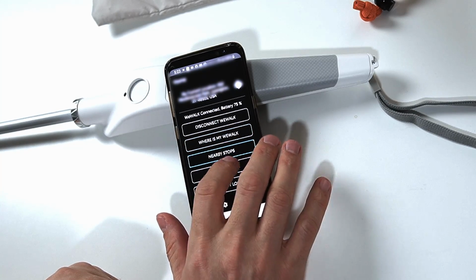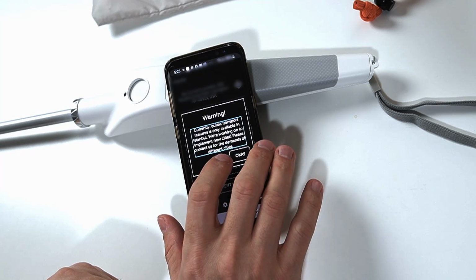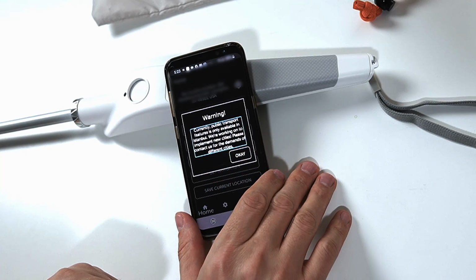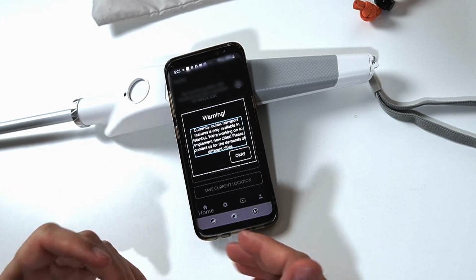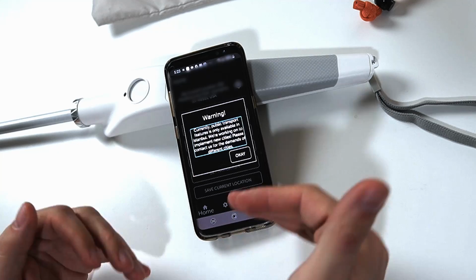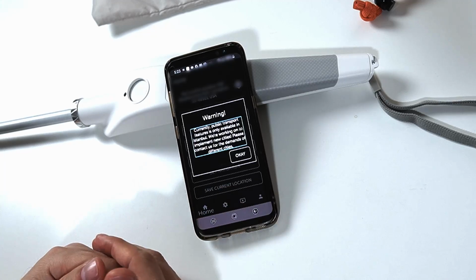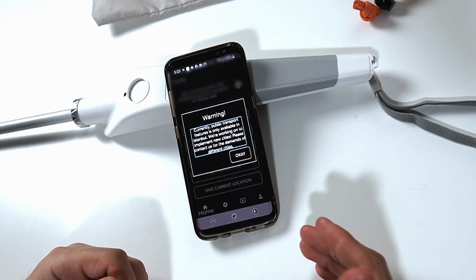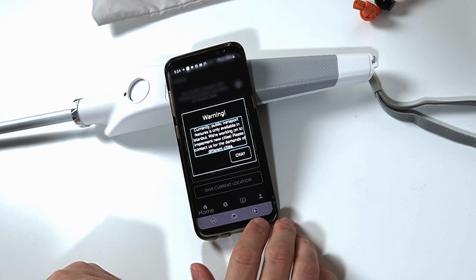Nearby stops button. Alert: language preference. Other. Alert warning: currently, public transport features are only available in Istanbul. We're working on implementing new cities. Please contact us for the demands of different cities. So this is nice. Unfortunately, this feature isn't available in the US yet. It's only available in Istanbul. But you can connect this to public transit and it will tell you bus routes, bus schedules, train schedules, and also direct you to train stations, bus terminals, things like that. So that's pretty cool. Hopefully that will come to more cities very soon.